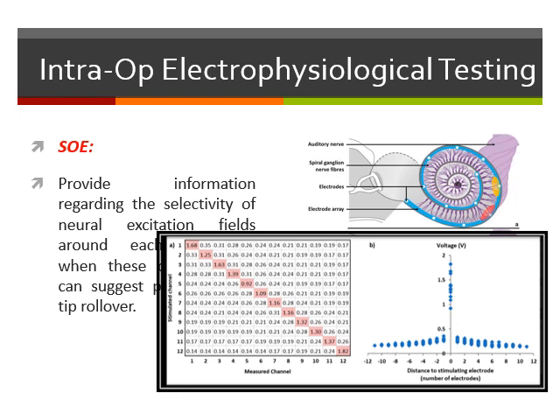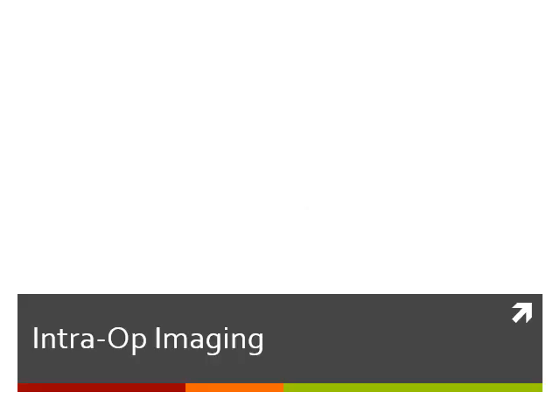Also, the new cochlear software has utilized this principle to predict the insertion of the electrode. As we insert the electrode array inside the cochlea, this function can give us an idea about the proper insertion and whether there's a full insertion or partial insertion of the electrode. But as I mentioned before, impedance and ECAP are the basic electrophysiological measurements that are usually carried out in all the cases by all manufacturers.